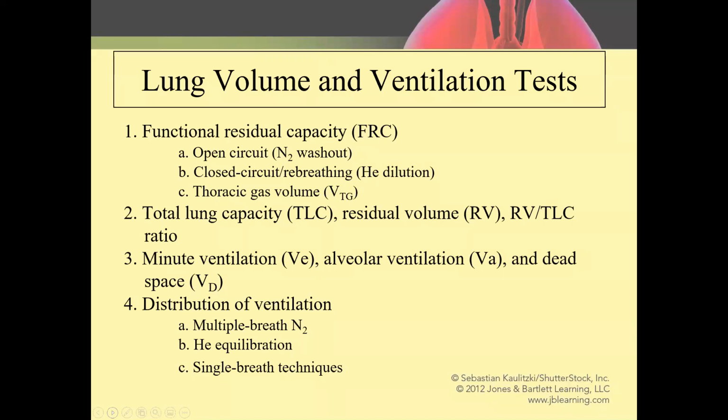So you're looking at the difference in exhaled CO2, and you can use some of those calculations to determine dead space. And from that, you can calculate things like alveolar ventilation. Closely estimate, I should really say.